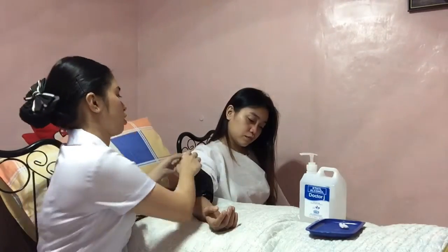So Althea, just relax because I'm going to repeat the procedure once again. So remove the cuff and disinfect.